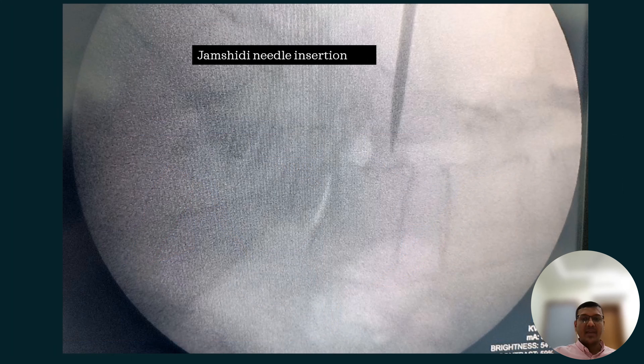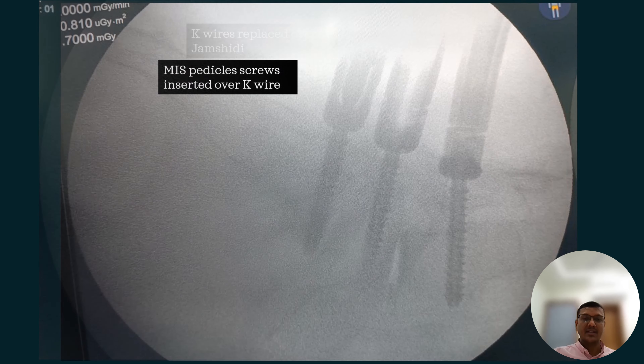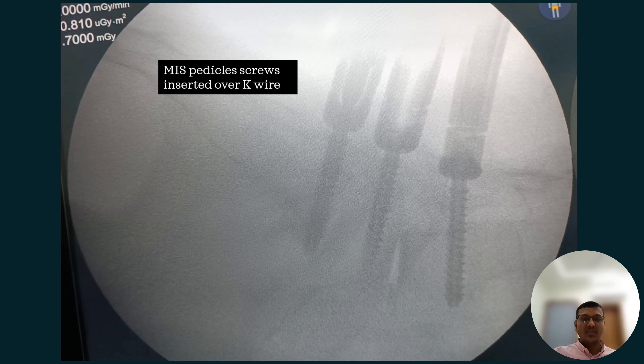We begin the case with MIS pedicle screws. From the left side, the Jamshidi needle is passed first, through which we place the K-wire, and over that we insert the pedicle screws. Then we introduce the rod and reduce the listhesis by distraction.